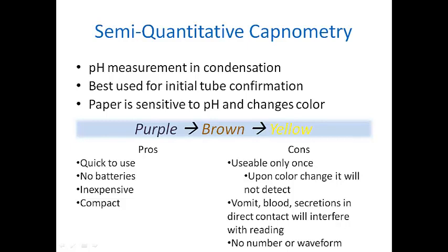There are some significant pros to using this device. It's quick to use, doesn't require much training. There's no batteries or technology associated with it. It's inexpensive, and it's compact enough to just keep in your airway kit for quick use.